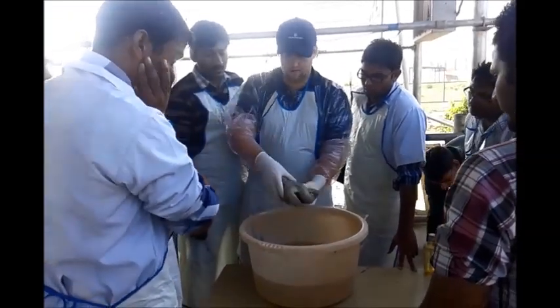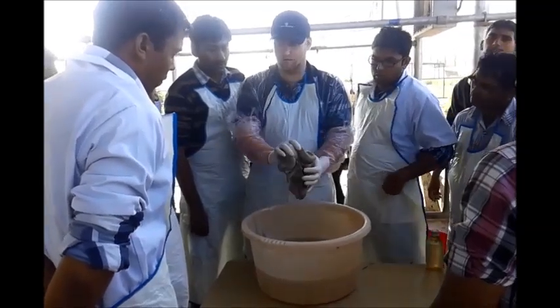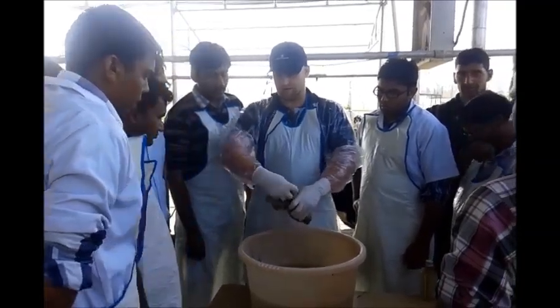So we get our cervix, lift up, move our hands forward, retract. Now we have our hands in here and we're going to straighten everything out.